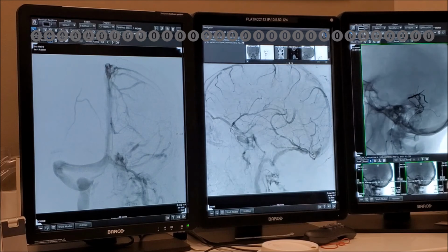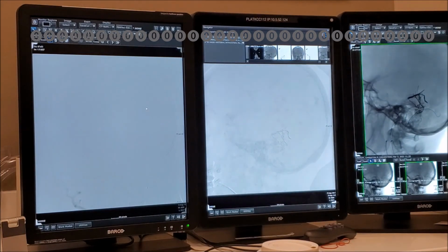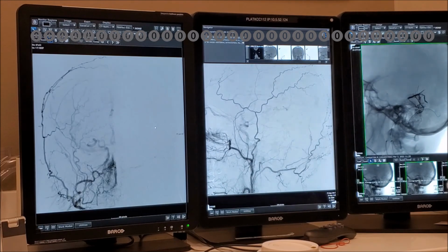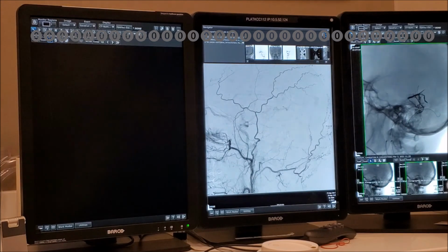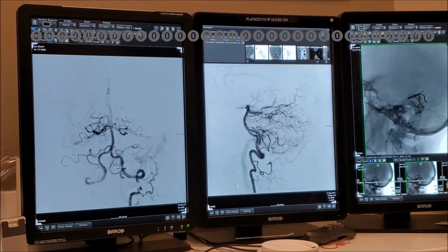So we reduced the flow enough, and maybe we pre-dilated that stenosis or arachnoid granulation to allow for a bit more drainage. Finish the dural fistula. Don't worry about the granulation. And then shut down so we can't see the MMA. Yeah, very nice. You got rid of the right contralateral supply. So there, yeah, I want to see this one. See, it is superior cerebellum.